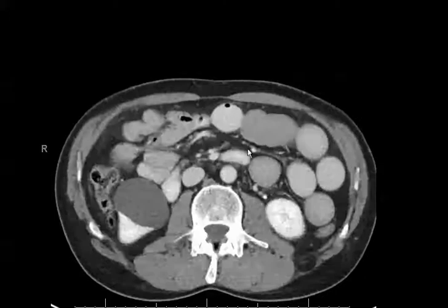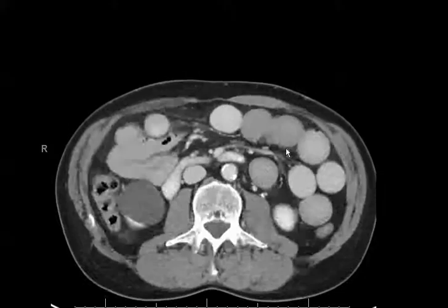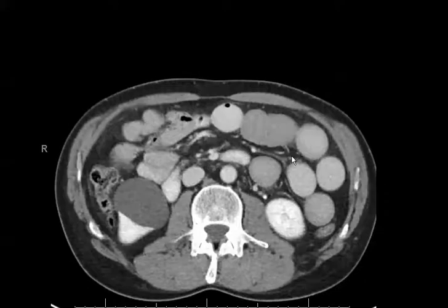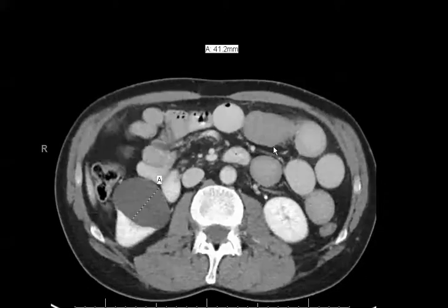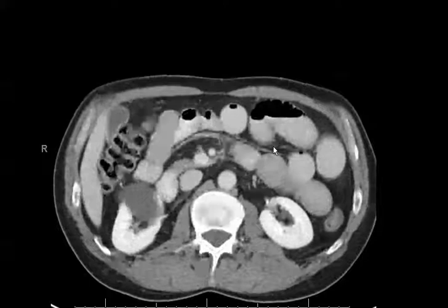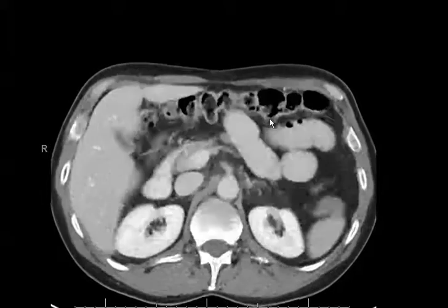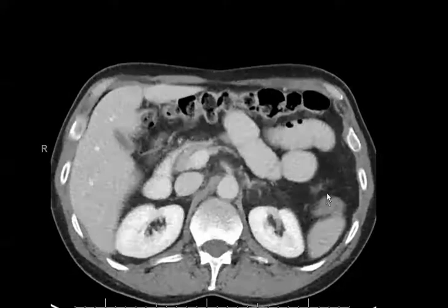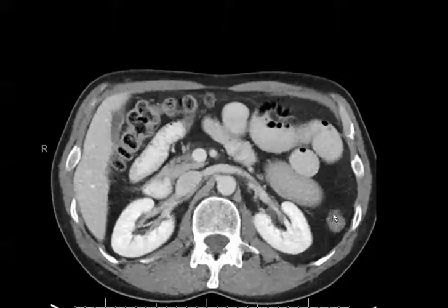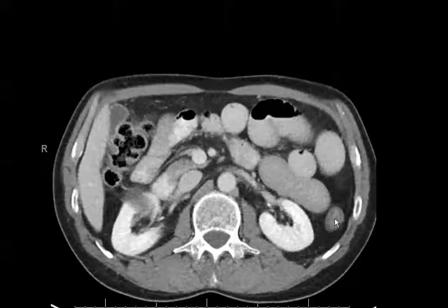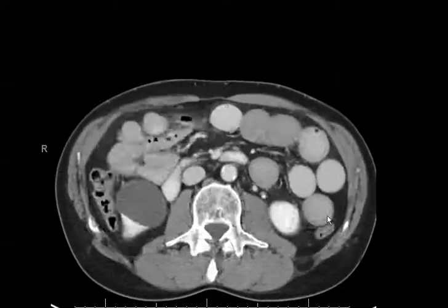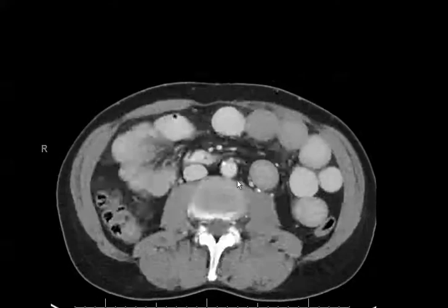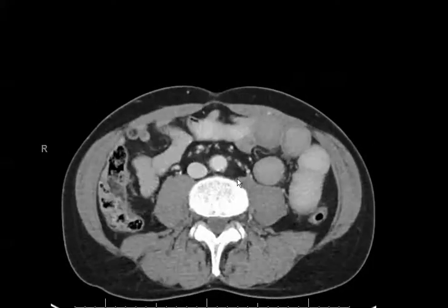Notice also that there are multiple dilated loops of small bowel, all measured greater than 3 to 3.5 centimeters. Some air-fluid levels are also noted. We can already tell that colonic loops are decompressed.